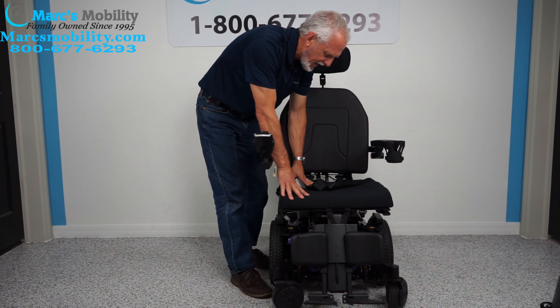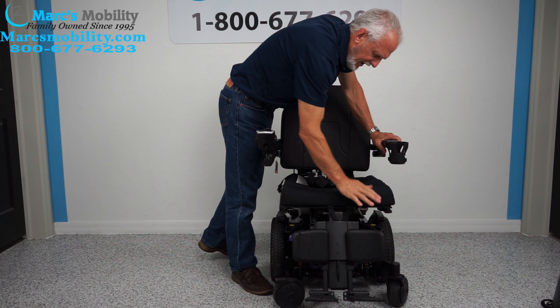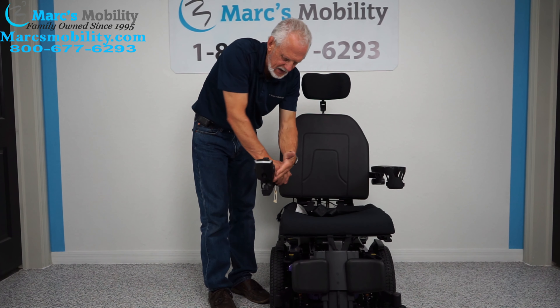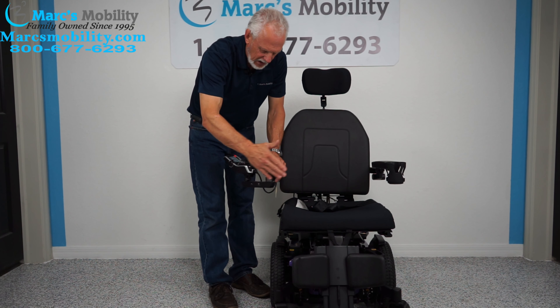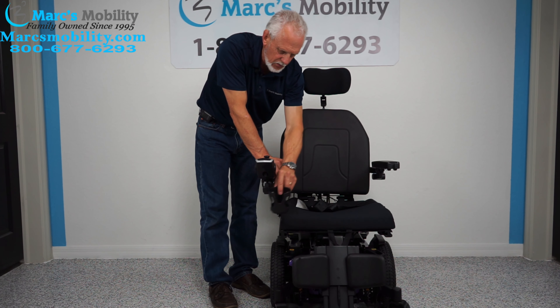It's not a real thick cushion — only about a two and a half inch cushion. Some people like that so they're lower down, but if you need a thicker cushion we can help you with that. The joystick is on the right. It is a swing-away joystick and you can get a lot closer to the table with a swing-away joystick. If you're left-handed, we can put the joystick on the left and put the cup holder on that side.